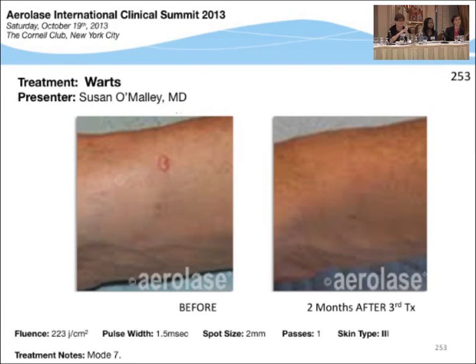So I won't say it's like anything else, anything is possible, they do show up. And this clearly was everything we've been trained as an intractable plantar keratoma. Right. No pinpoint bleeding. Skin line disruption is always questionable when they're that dense, though. So that's important. Okay.